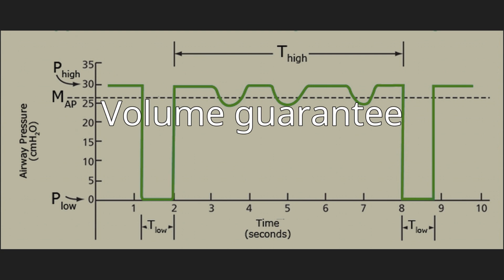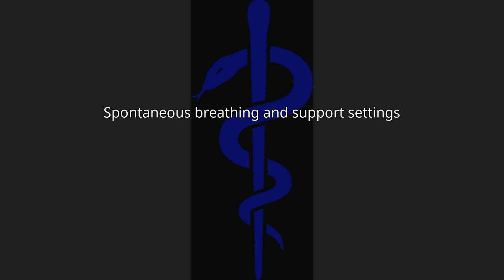Volume guarantee, an additional parameter available in many types of ventilators that allows the ventilator to change its inspiratory pressure setting to achieve a minimum tidal volume. This is utilized most often in neonatal patients who need a pressure-controlled mode with a consideration for volume control to minimize volutrauma.